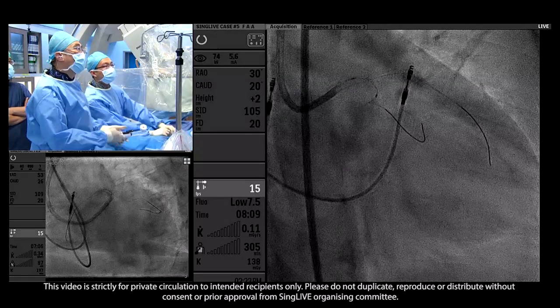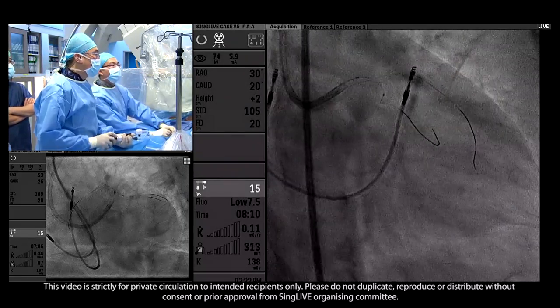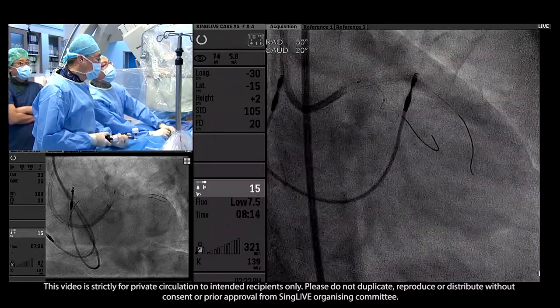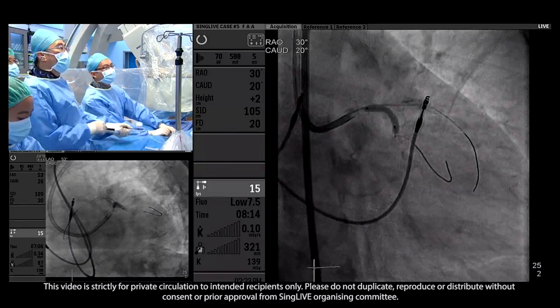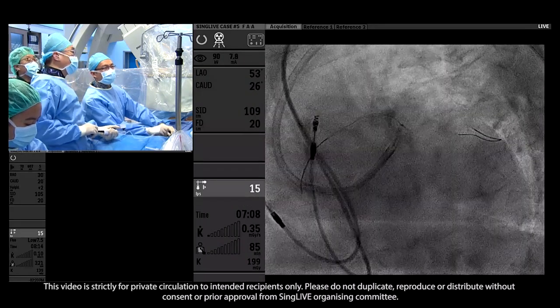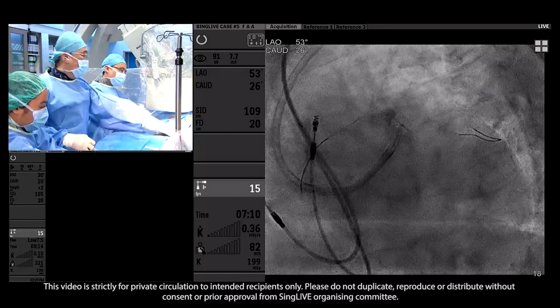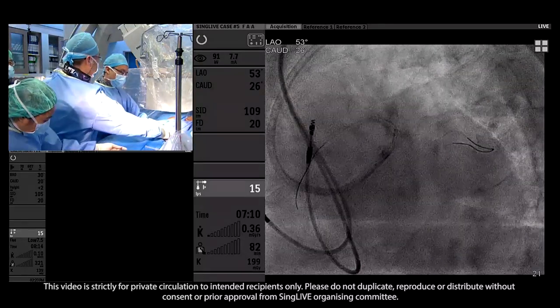Okay, first thing, I would first do an IVUS. Need to see what really is happening down there, whether we really need to stent in the first place. I agree with Dr. Junko. But it's too late, already dilated. No, they wanted to dilate it because they wanted to put in the IVUS. This is a 2.75 NC balloon. Okay, good. I think it's fine for both TAP and DK crush. I mean, their preference. Hayashi?